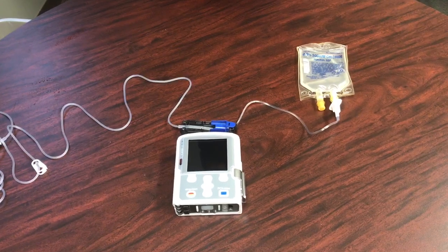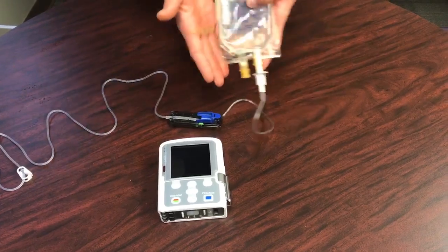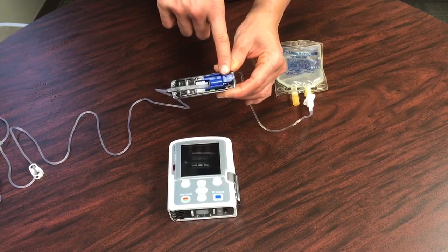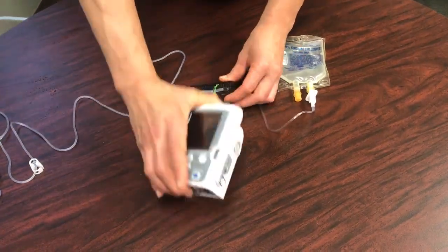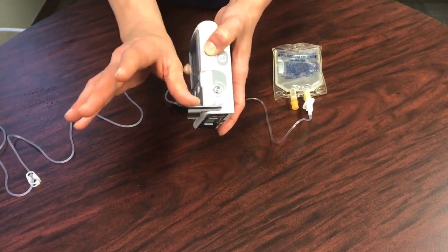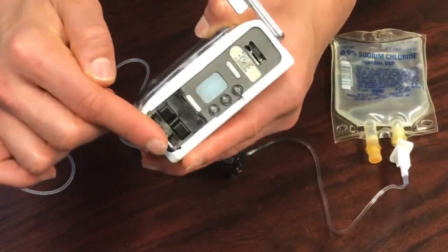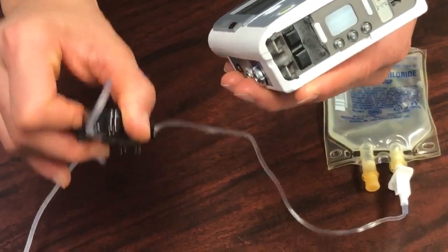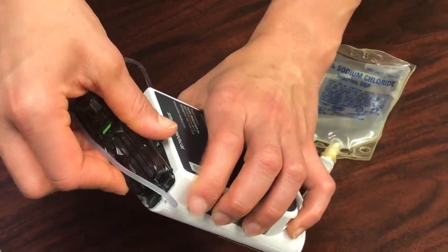The next step to setting up your CADD-Solis pump is attaching the cassette tubing to the pump. After you've punctured your bag of medication, go ahead and grab the cassette. This blue piece can be removed and thrown away. On the side of your CADD-Solis pump is a lever — bring that lever down. On the bottom of the pump are two hinges, and on the cassette itself there are two hooks, so attach the hooks to the hinges found on the bottom of the pump.